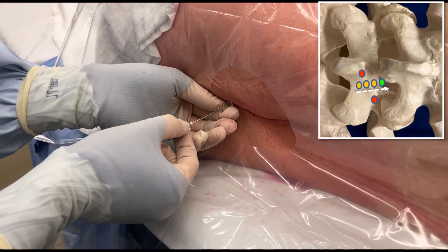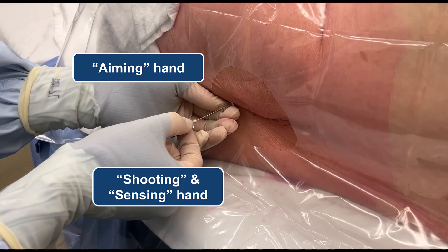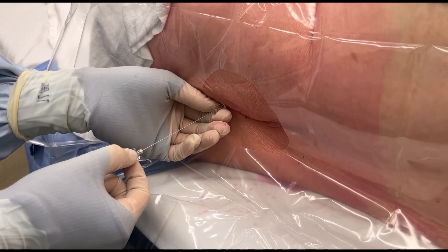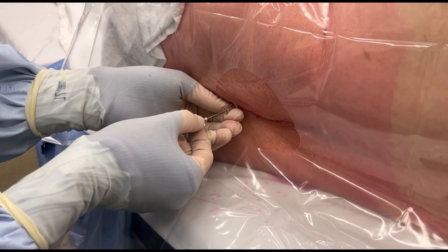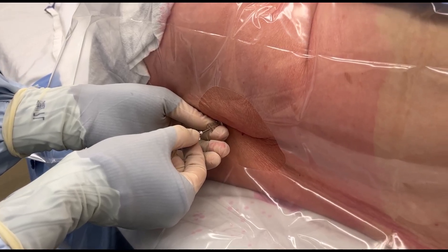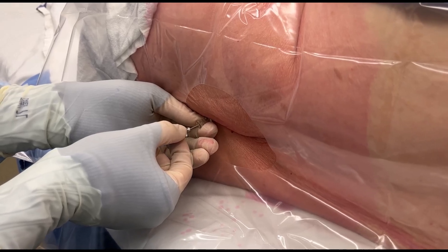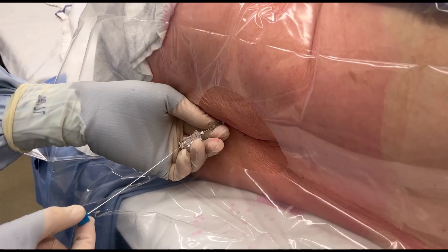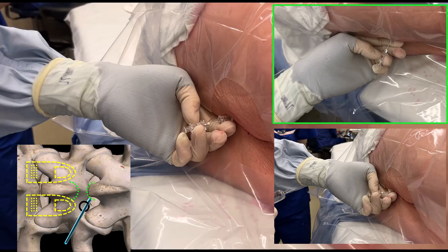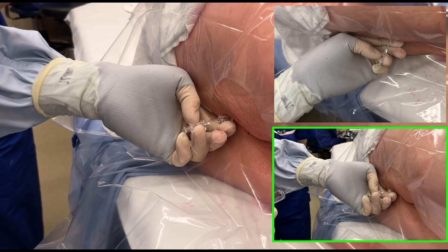These redirections must be small and incremental. The left hand controlling the introducer needle is the aiming hand; the right hand merely advances or withdraws the spinal needle in a straight line. Repeat these steps as needed: needle withdrawal, cranial redirection, reinsertion, until you feel the needle tip slip off bone and advance deeper into the rubbery resistance of ligamentum flavum. Keep advancing through the flavum in a stepwise fashion, withdrawing the stylet intermittently — or if a paresthesia is elicited — to check for CSF backflow signifying dural puncture. The eventual cranial angle for success will depend on how wide the interlaminar spaces are and the location of the initial skin insertion point. Note that the lateral to medial angle remains unchanged from the original 5 to 10 degrees.